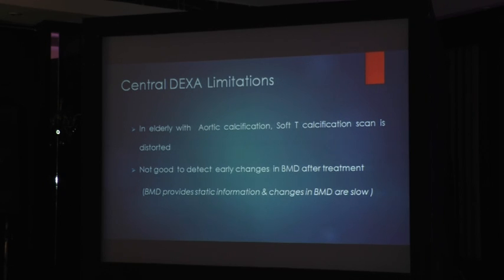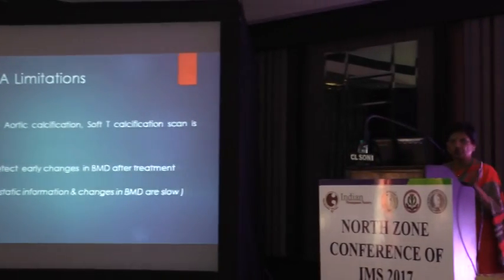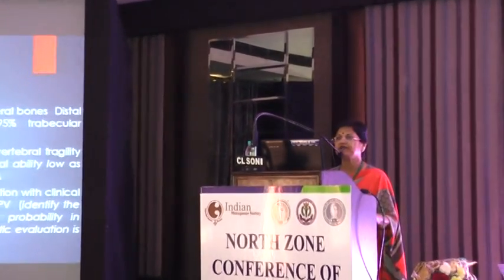With central DEXA in elderly patients, where there is aortic calcification or soft tissue calcification, the scan is again distorted. It's also not a very good method to note the changes during the treatment.